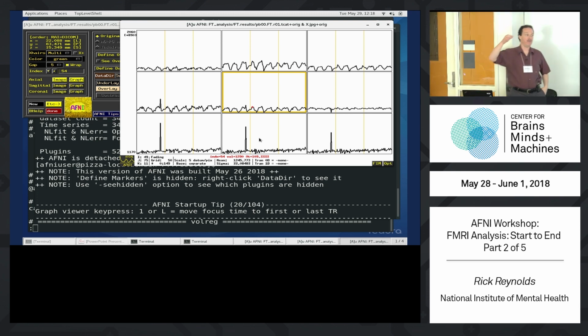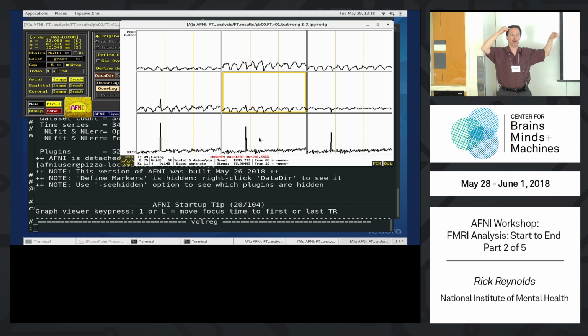And remember, voxels are far apart. These are 3 millimeter voxels, 2.75 squared by 3. That's pretty far apart in space. If the subject moves even a little bit, now they move from a voxel center here down to here. At one point in time you have data here, at one point in time here, and you want to resample it back to here on that moved grid, you don't have data there. It doesn't exist. You have it here and here and here and here, but not in the middle.